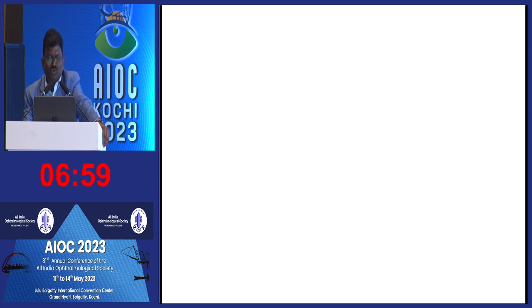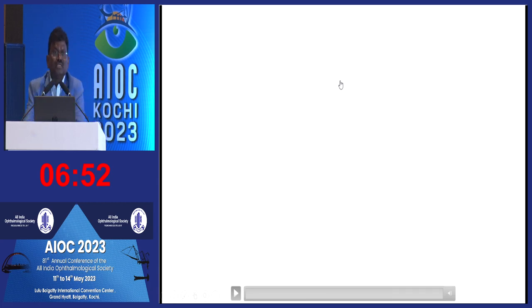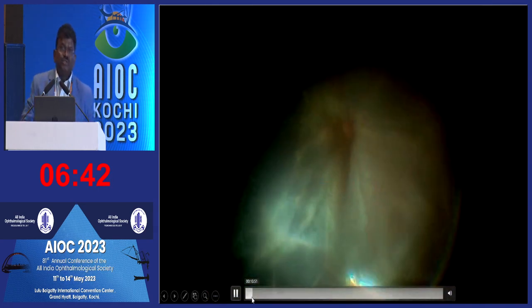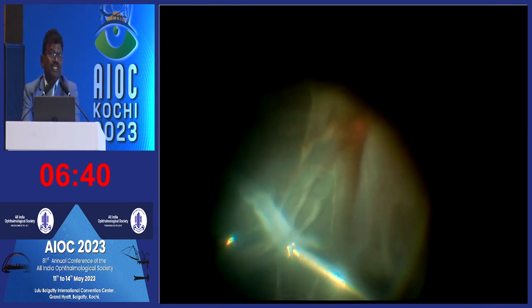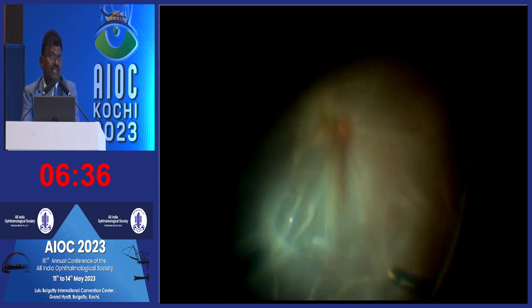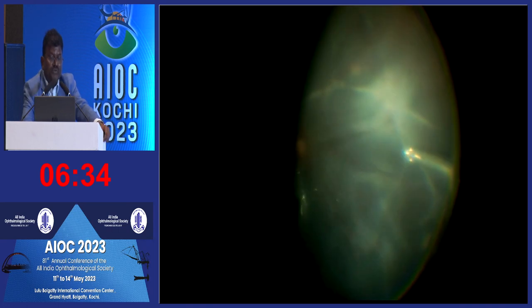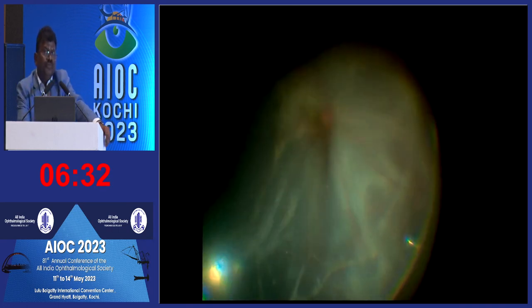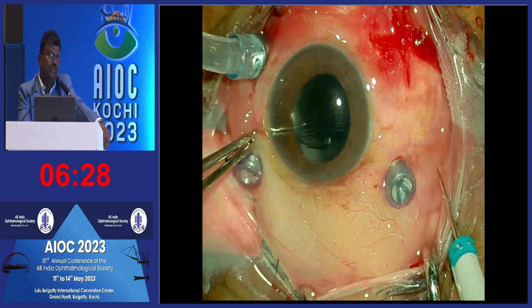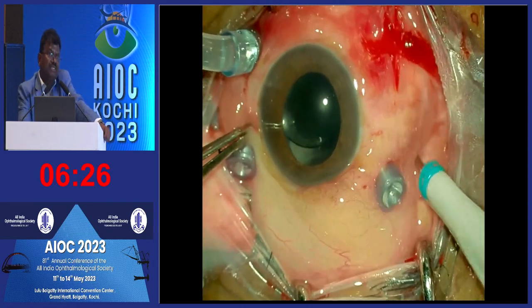These are my disclosures. We all know that subretinal gliosis is quite common in chronic retinal detachment, and that hinders the settling of the retina. What we do in this case is a minimal vitrectomy. You can see multiple subretinal bands. Extensive subretinal gliosis could be noted in the nasal region and around the disc. Very little vitrectomy: one of the clues is don't do a complete vitrectomy, because that will settle the retina.